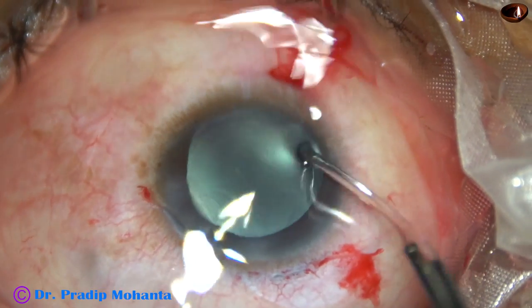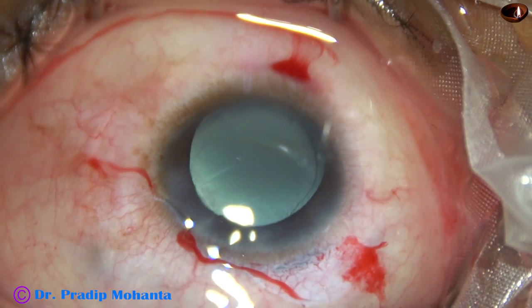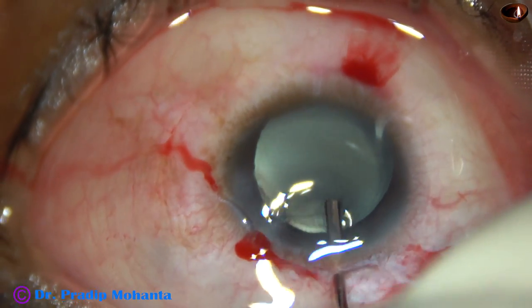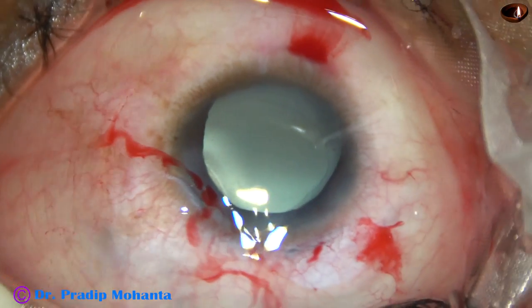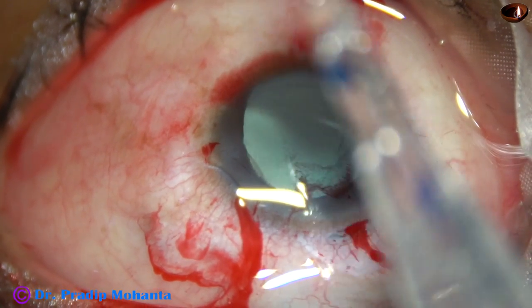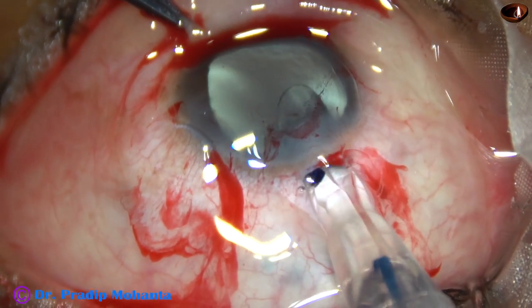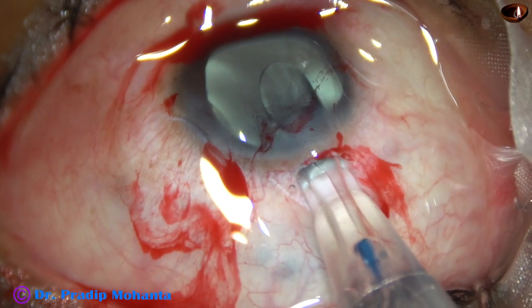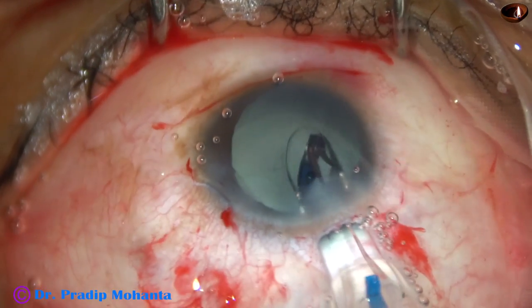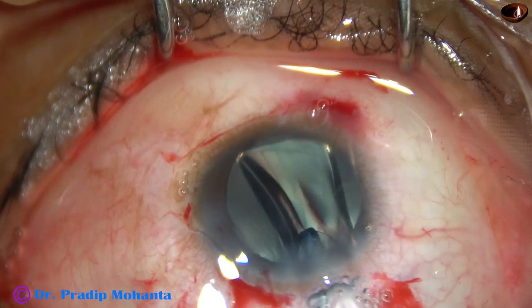Cortex has been satisfactorily removed. The posterior capsule is clean. Now we have to implant an intraocular lens. Some of my colleagues advised to keep the patient aphakic, but I decided to put an intraocular lens. The intraocular lens power is 18 diopters. Now the lens is being injected into the capsular bag. This is a Hoya ON50 from Japan.